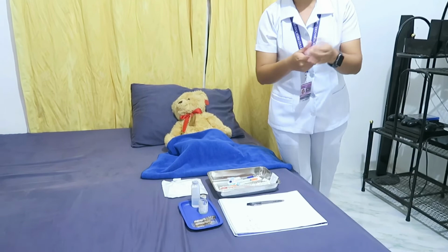Now let's proceed to the other parenteral medication, which is the intramuscular medication. So let's prepare. So first is to perform hand hygiene and observe other appropriate infection prevention procedures. This is to deter the spread of microorganisms. So let's perform the hand hygiene.